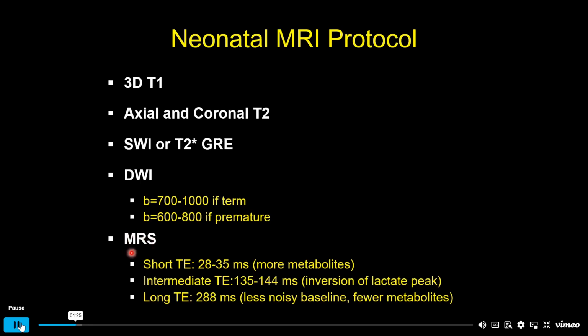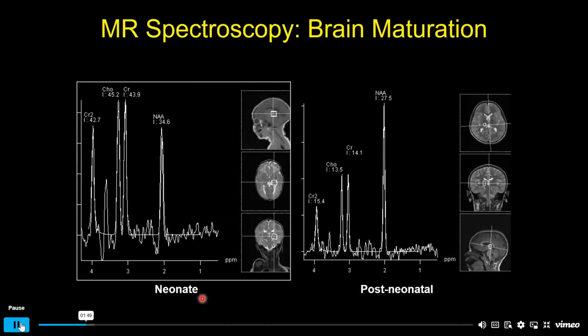And it was also mentioned on the first day, I believe as Dr. Whitehead, MR spectroscopy. There are some differences in the baseline for long versus short TE, and it's preferential to do both if you have a suspicion that it's something else other than HIE. For detection of lactate in HIE, I typically prefer just a long echo time spectroscopy.